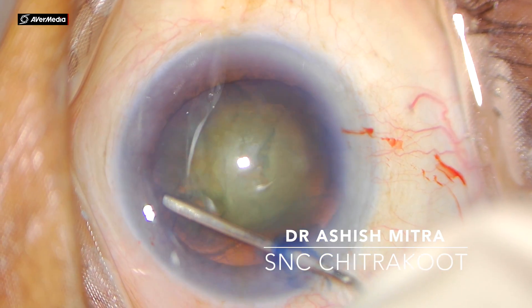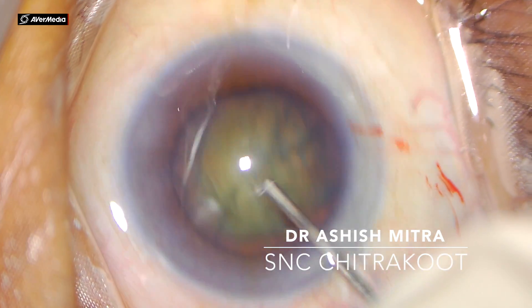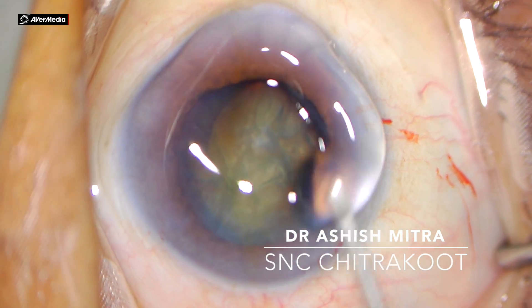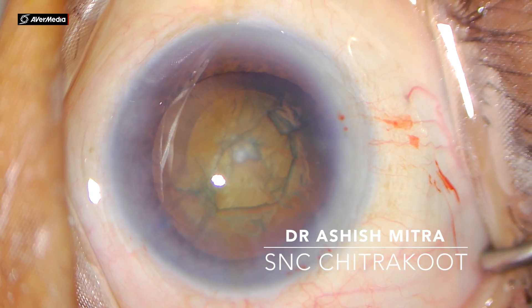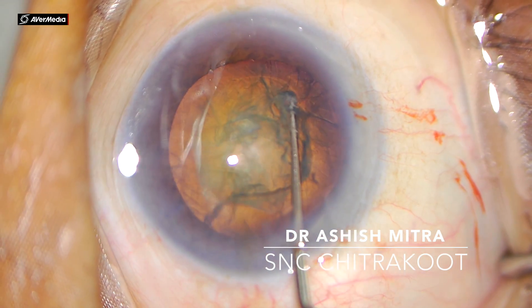With the hydro cannula I would be going inside, tenting the capsule. Inject the fluid — you can watch the fluid wave — tap, then again tent and tap again. After you've done a good hydrodissection, at the end of the surgery there is very little cortical material left, so a good hydrodissection is always ideal.